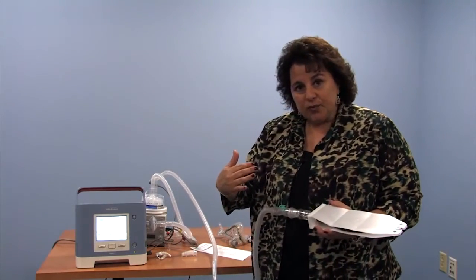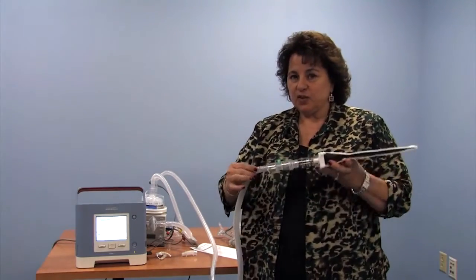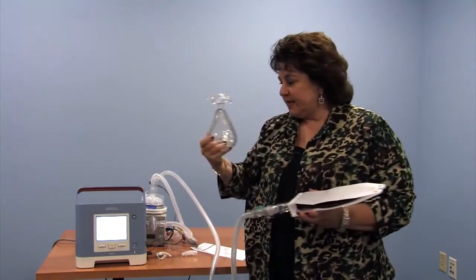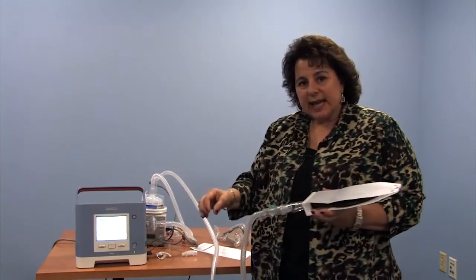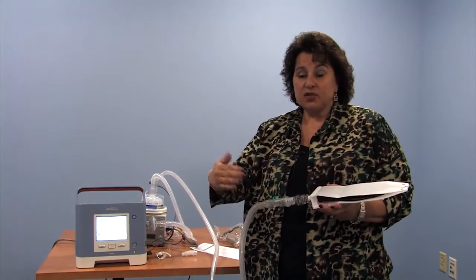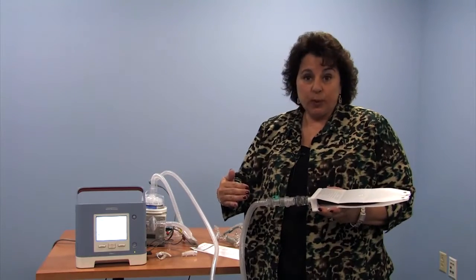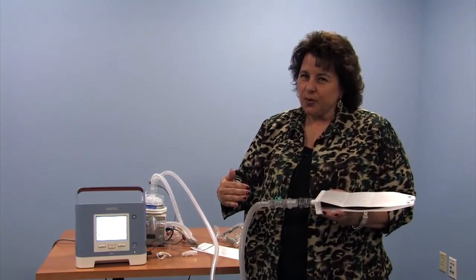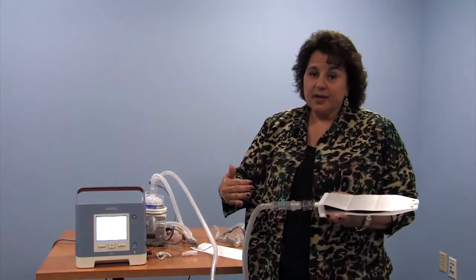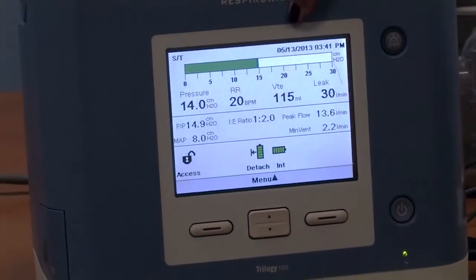What we typically use for infants and children who require what you might call pressure support because it's to a tracheostomy tube, or BiPAP if it's to a face mask, is the spontaneous timed mode. This allows for a backup rate in the event that the patient doesn't breathe above a certain rate that you set. What we find in young infants and children and those that are weak, those particularly under maybe 2 years old or so, they have difficulty during times of illness or due to their size in triggering or turning on a breath. So right now, when you look at the machine, you don't see that little black ball.